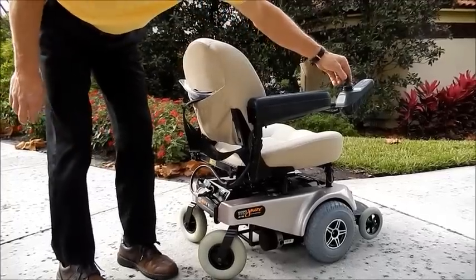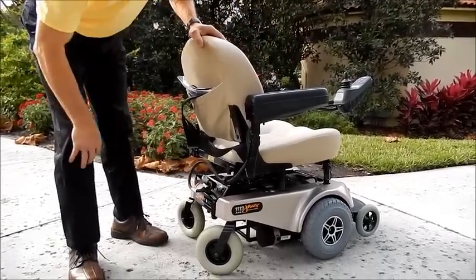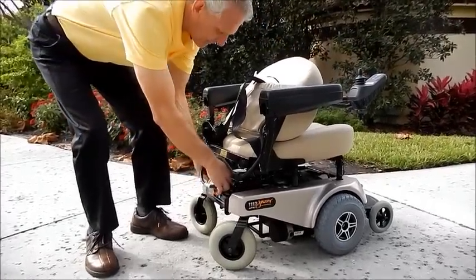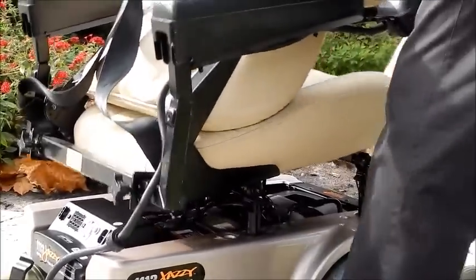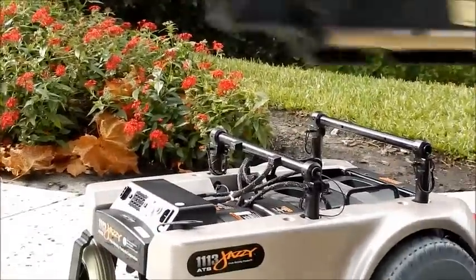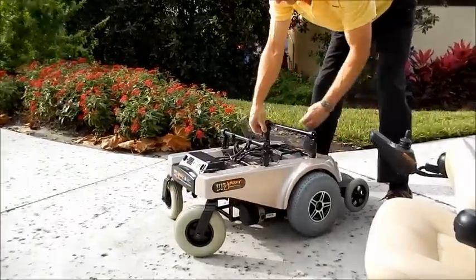This chair also comes apart. If you want to take this chair apart, all you have to do is disconnect the back, take the seat off, and take these two pins out.